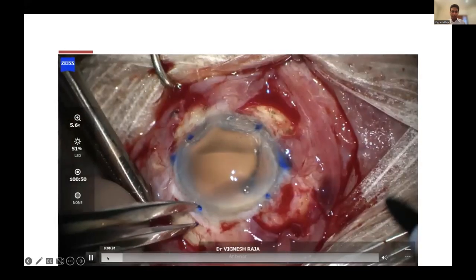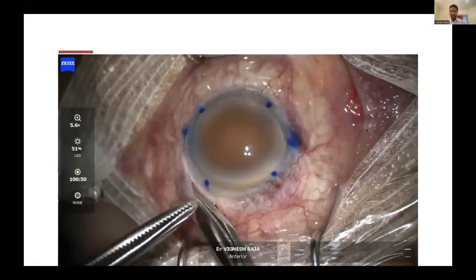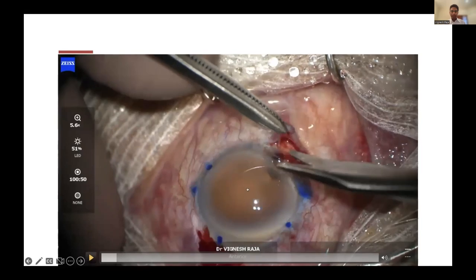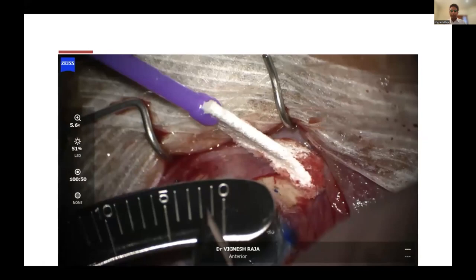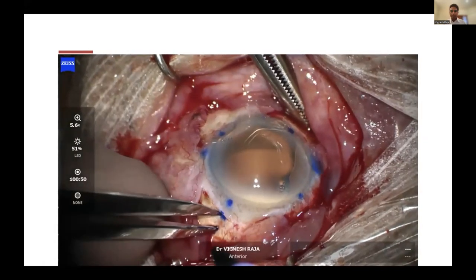Let me just go back to the video. So what I'm doing is I'm making a peritomy there, and I've marked the toric marks here. Let me pause the video. So these are the toric marks, the implantation axis of the toric. And I'm just going to mark 1.5 millimeters from the limbus and 3 millimeters from the limbus. So 1.5 there and another 1.5 in the back.